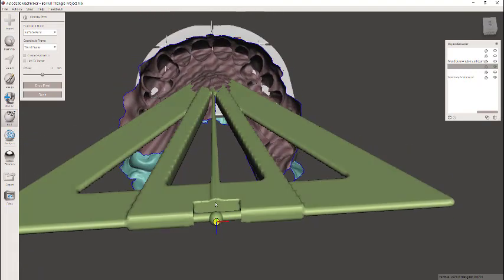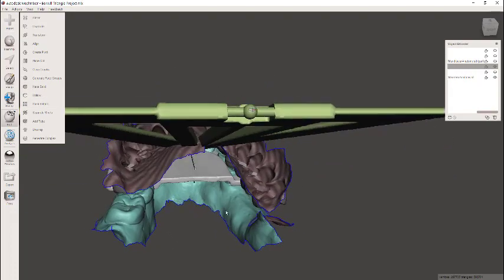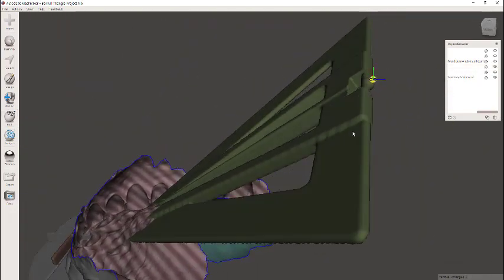And there you see my hinge. And then once I've done that, I need to drop the pivot and then click Done. So now we have a pivot. And this pivot you can actually click on as if it were its own object.